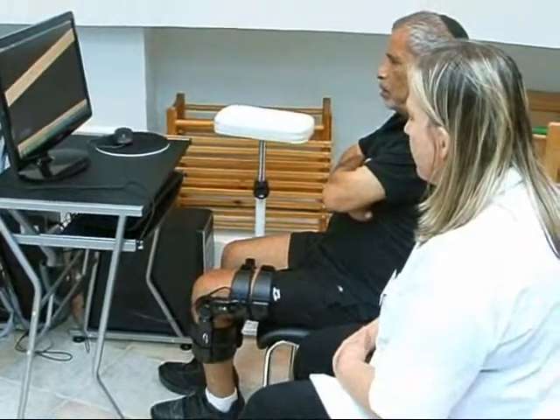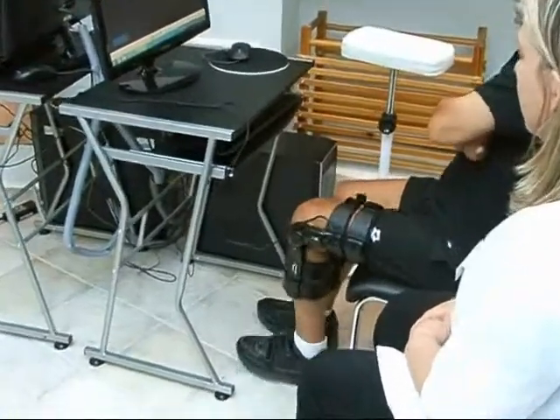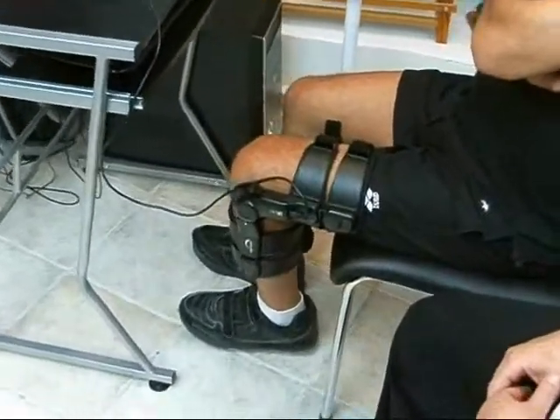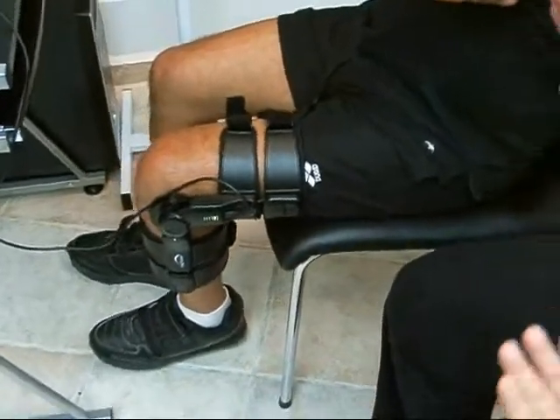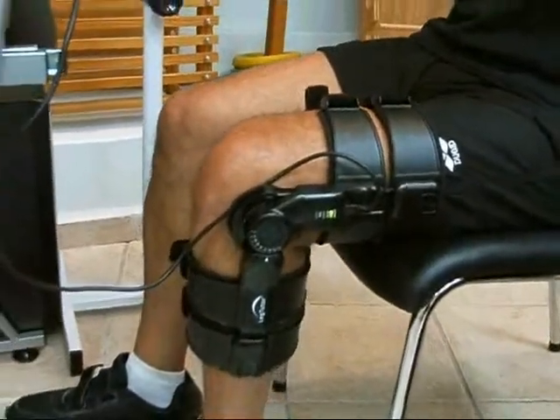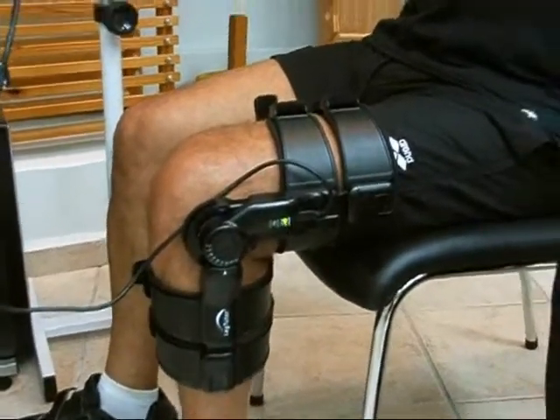The Leg Tutor is a wearable movement detection and motion feedback device that can sense knee extension and flexion as well as hip three-directional movement. The Leg Tutor is indicated for leg movement dysfunction following neurological or orthopedic injury and disease. Here you see the patient performing intensive active hip flexion and extension exercises in the sitting position according to his movement ability.